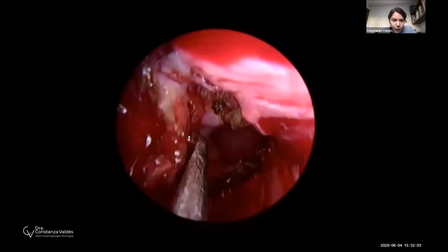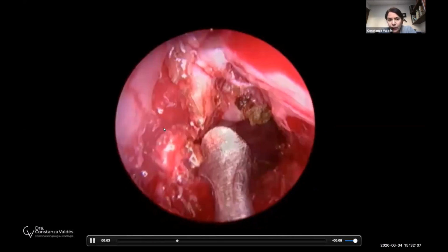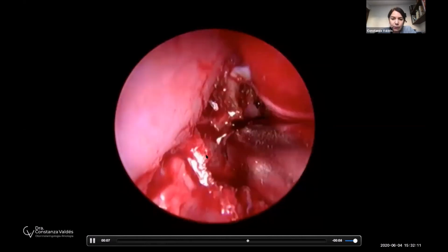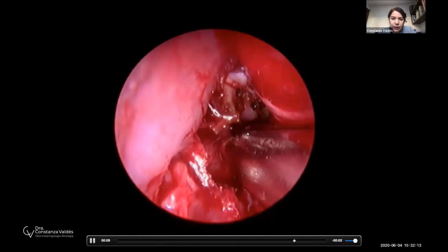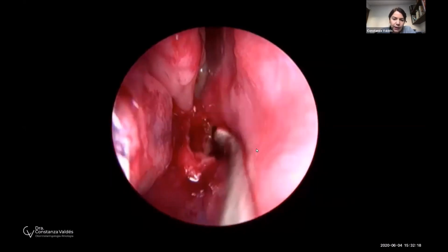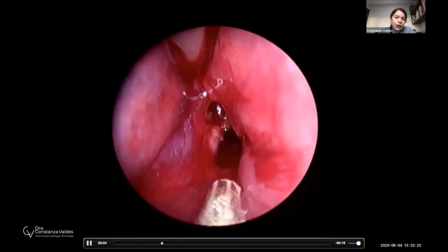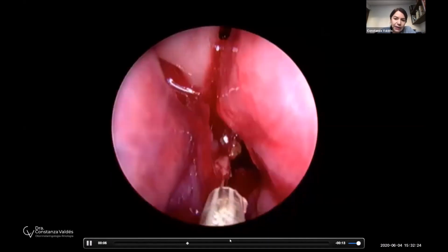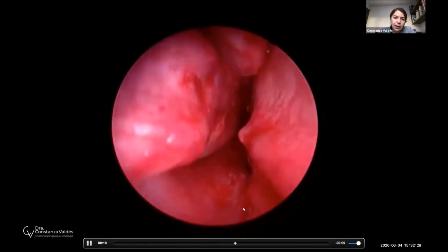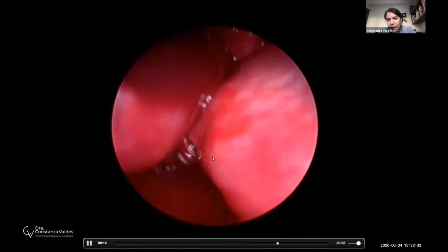So, and now here you can see the pterygoid plate, and we have to drill that so we get more space. It's very important to drill it. And you see the diamond burr that's protecting here also the flaps. And sometimes the septum you see comes over here. So you have to do some relaxing incisions in order to put the septum in the middle part. Also with the backbiter, you can cut it.